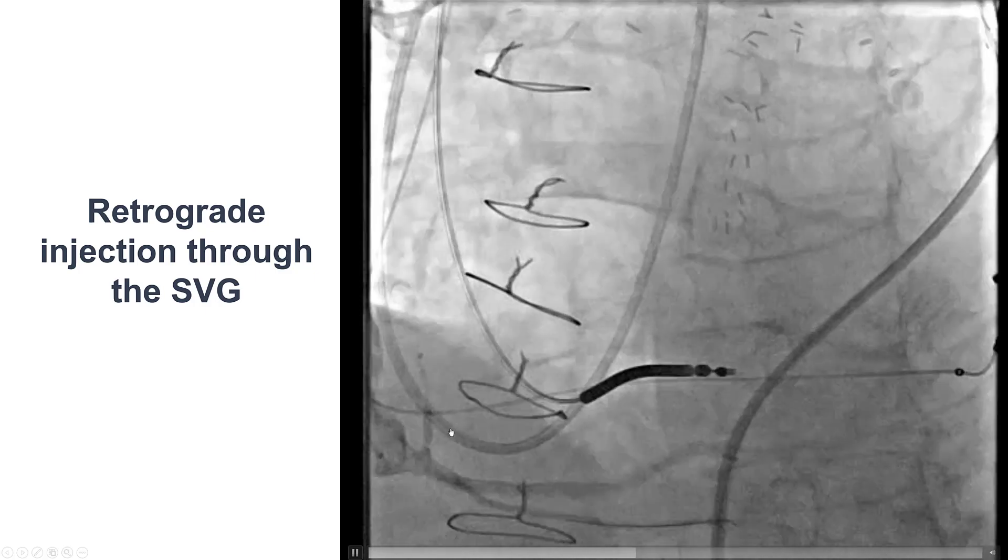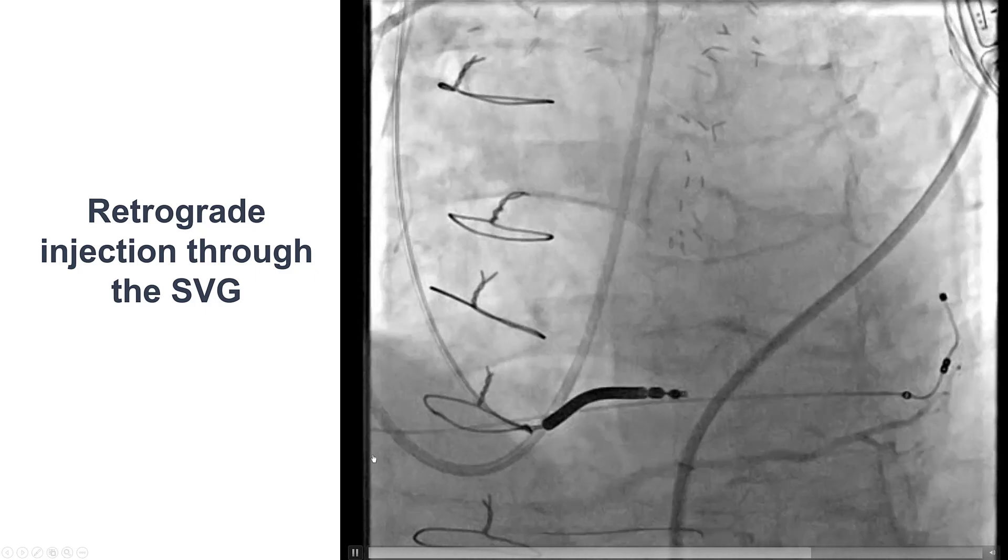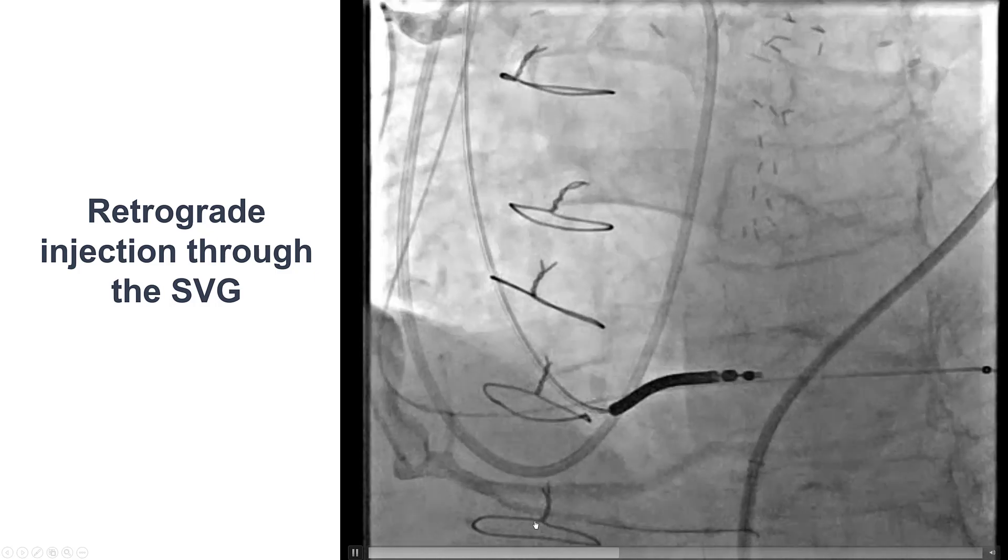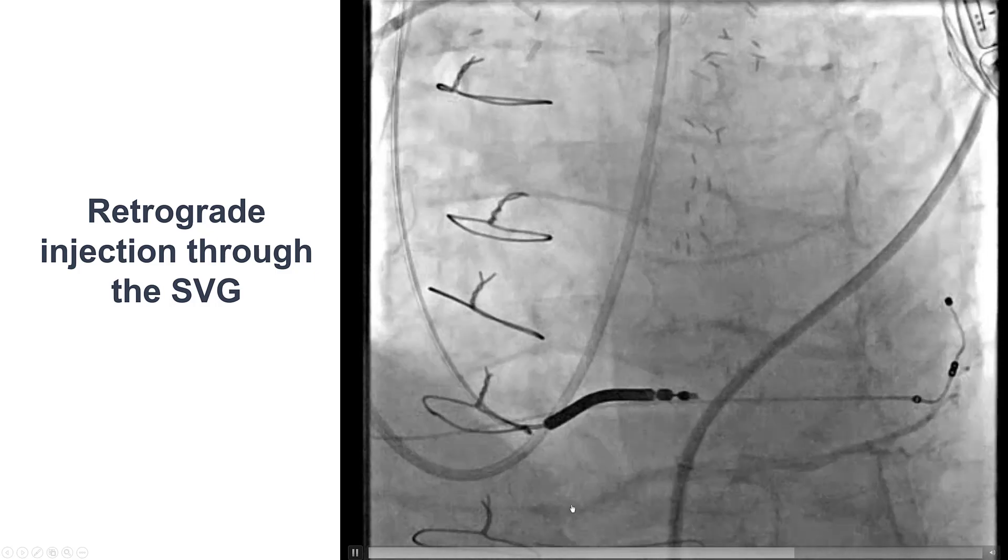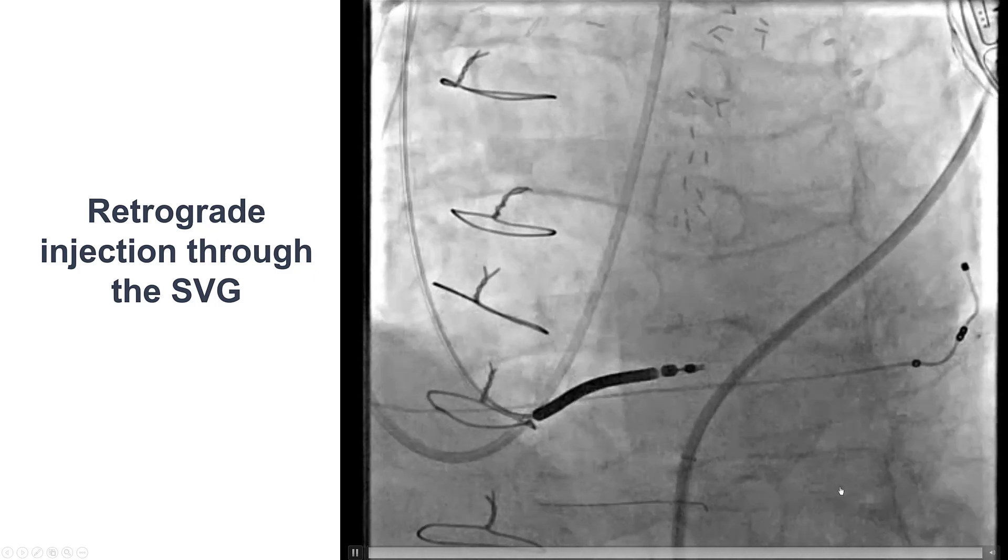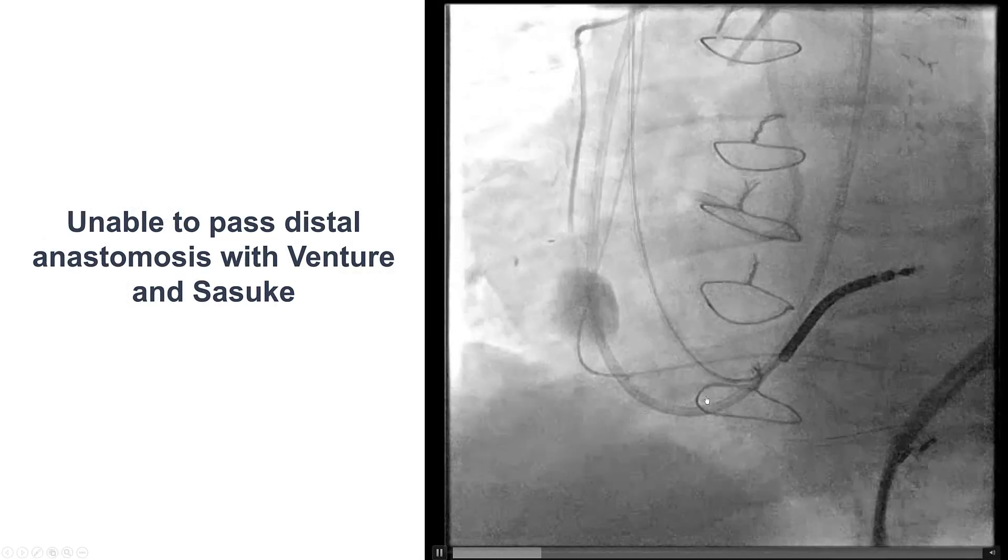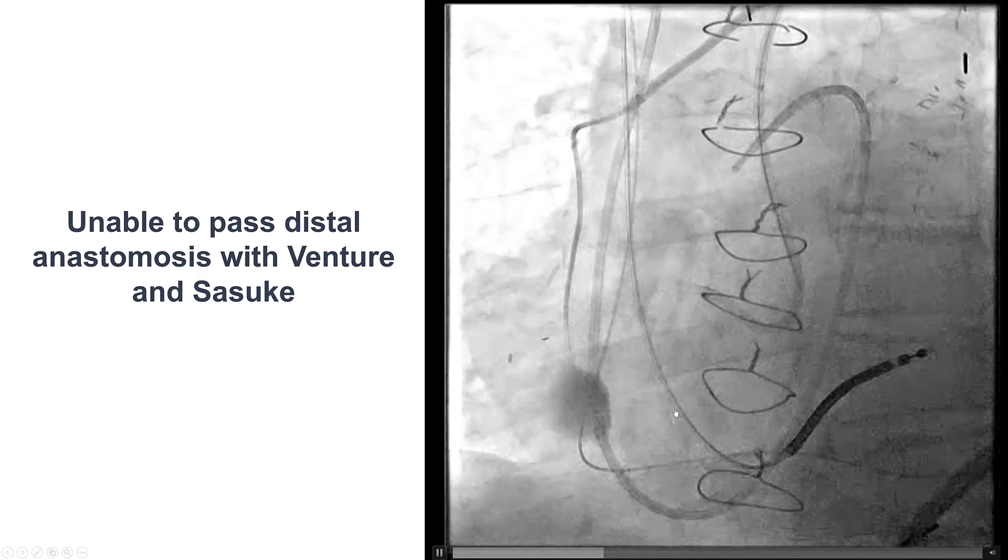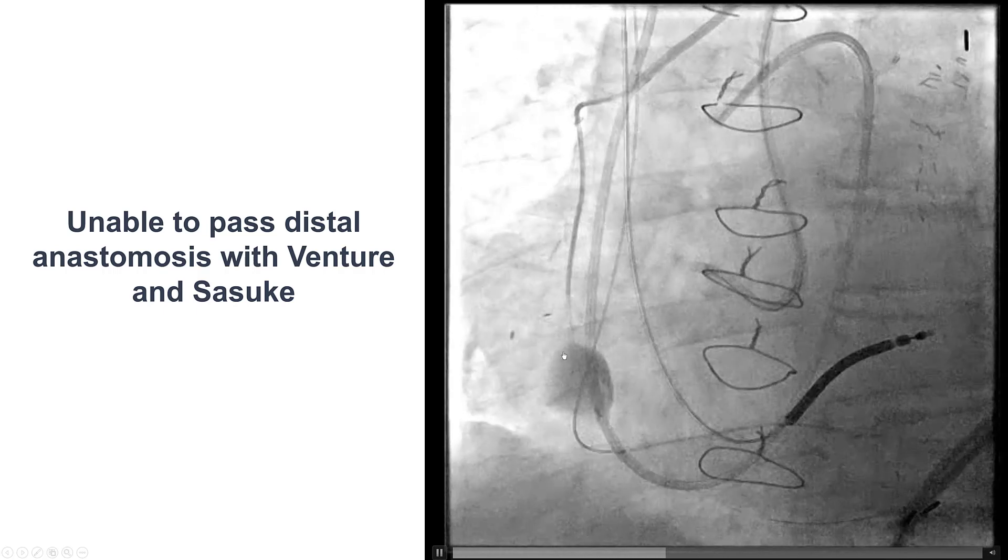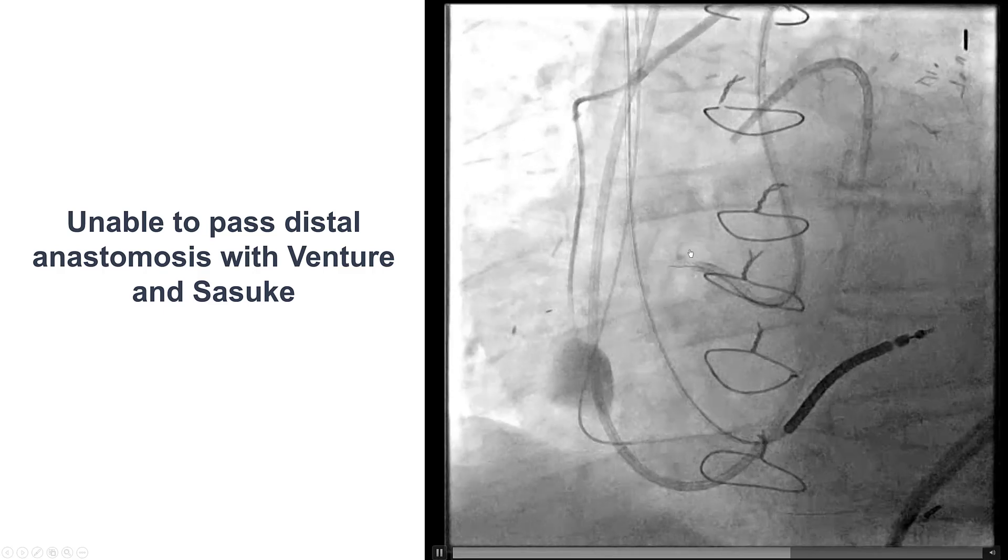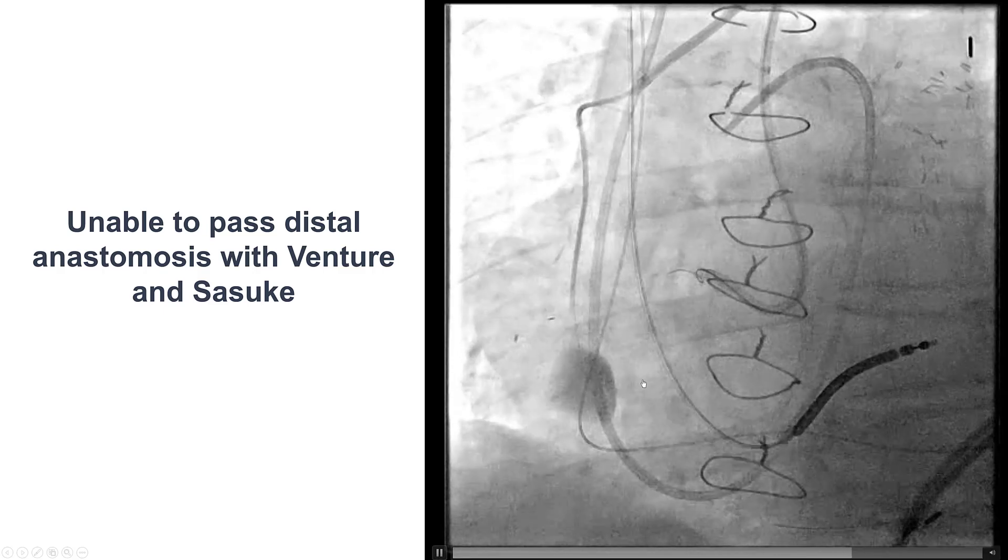We were able to advance the guide extension through the SVG aneurysm and perform an injection. And now we can visualize a little better the distal vessel, which is of good size with a large right posterolateral vessel. We did multiple attempts to pass a guide wire retrograde from the saphenous vein graft into the distal right coronary artery going towards the proximal side, but we were unable to do that.